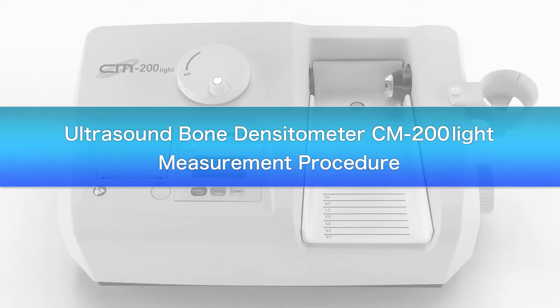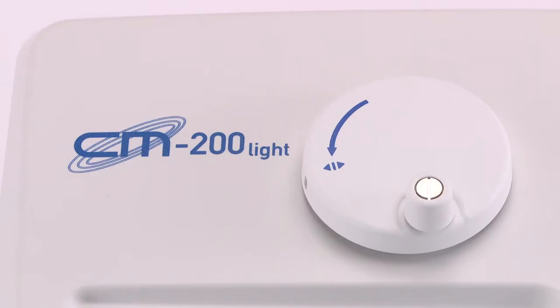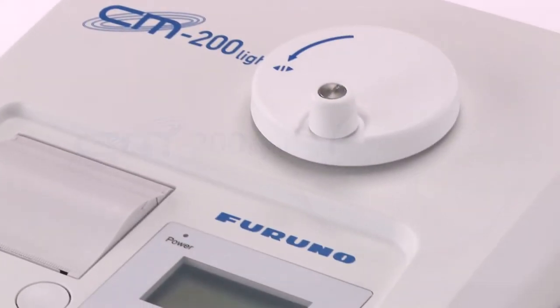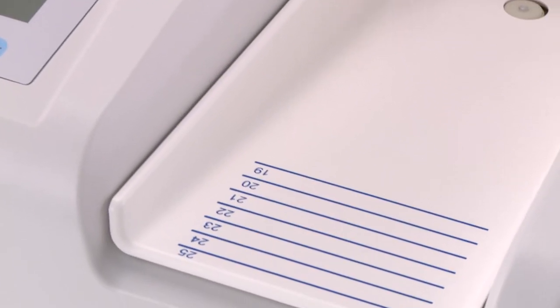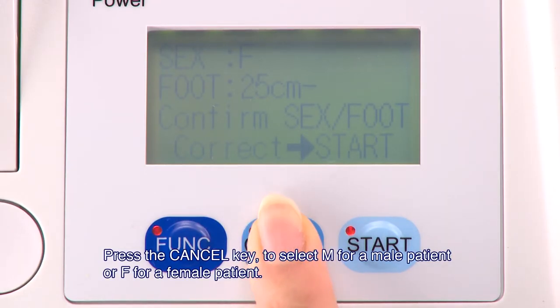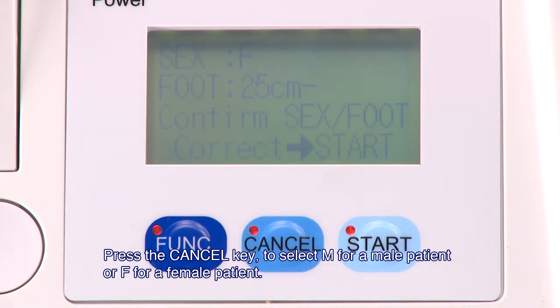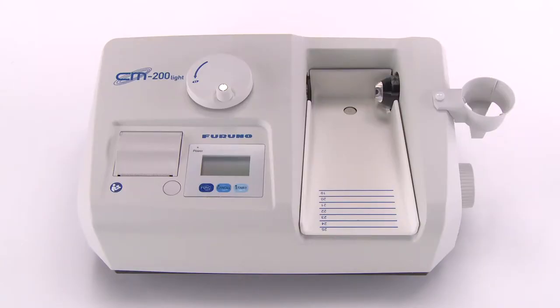We will now explain the measurement procedure with the CM200 light produced by Furuno Electric Company. Press the cancel key to select M for a male patient or F for a female patient. This completes the pre-measurement data input. We will now proceed to the preparation for the actual measurement.